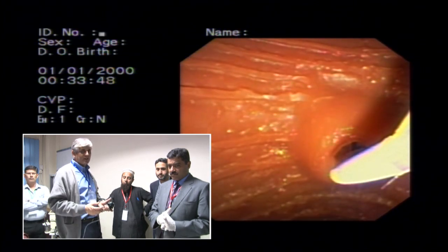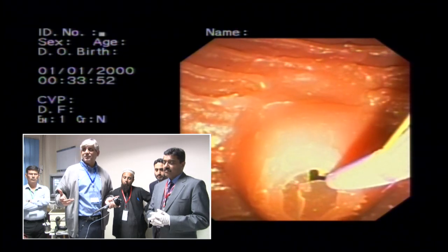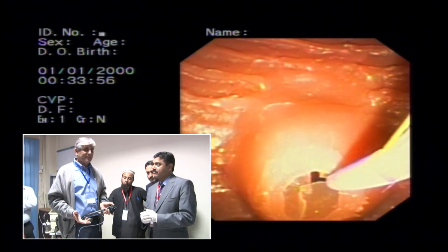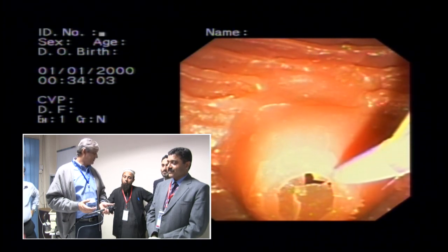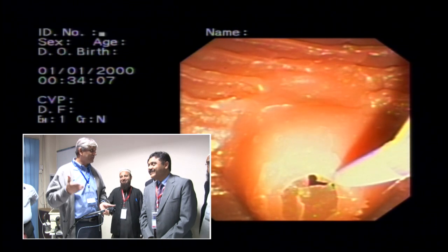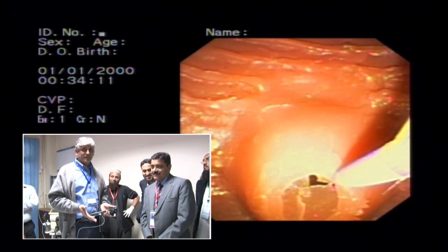Needle knife करने से होगा ये कि आप cannulation में interest भी नहीं होंगे, आपने 2-3 दफा certain experience के बाद is a different thing. I have been doing ERCP since 1991. And a lot of you did not even probably pass your medicine. Okay? Medical college in New So 1991 and today is 2015. It's 24 years of ERCP.